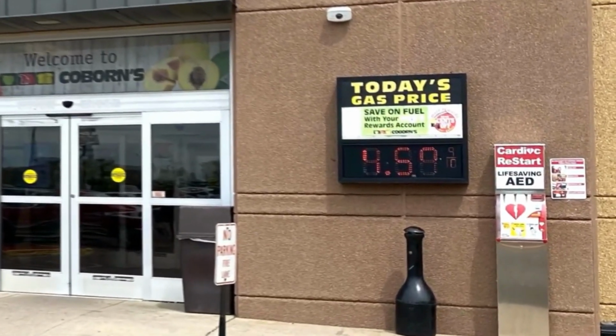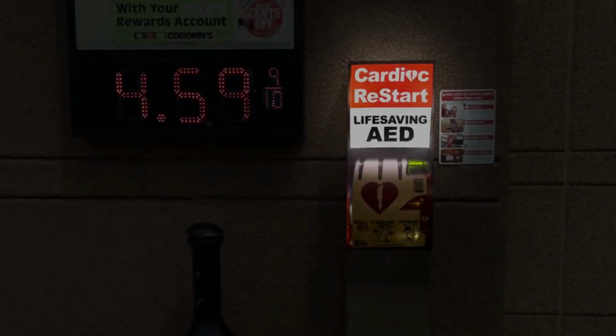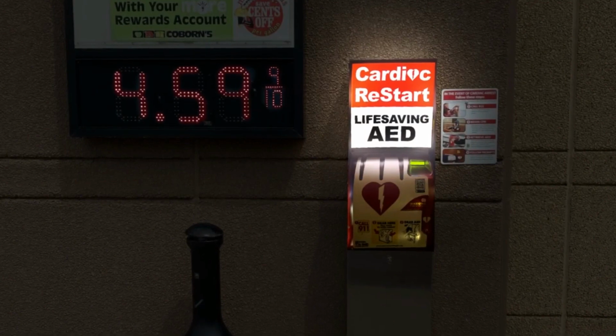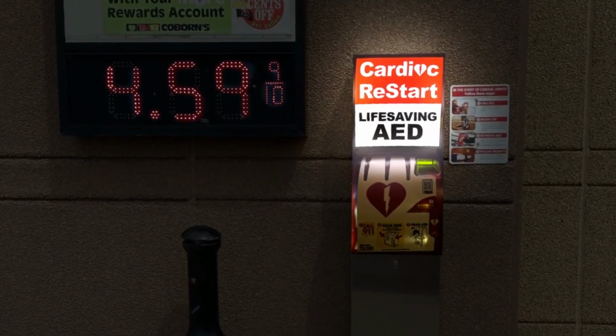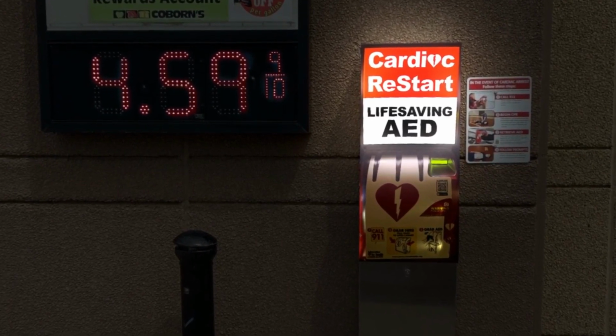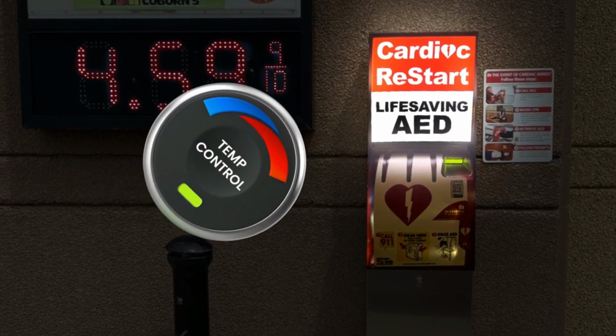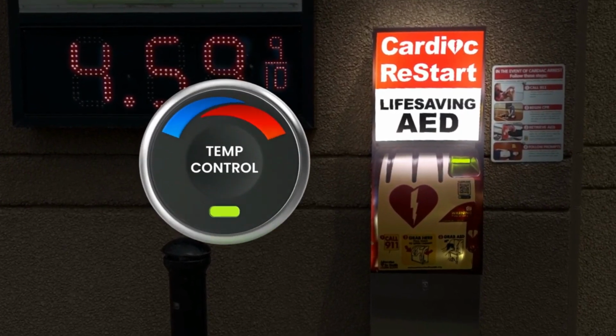Another option is to have the AED outside on a wall. This is a great option because if a building locks at night, the AED can always be accessible. While we want to take into account the same things we talked about before, when placing an AED outside, we also want to make sure that it's temperature controlled. So again, the AED is always ready to help save a life.